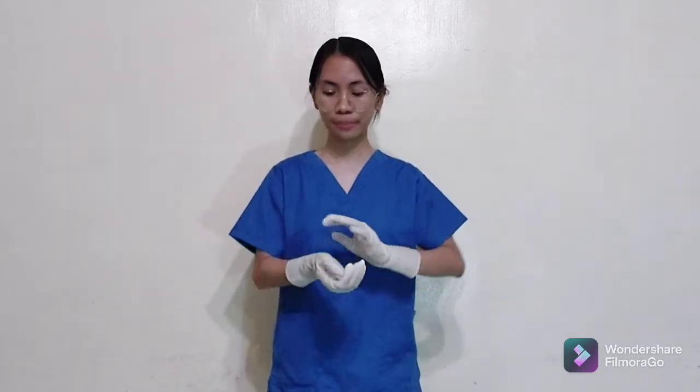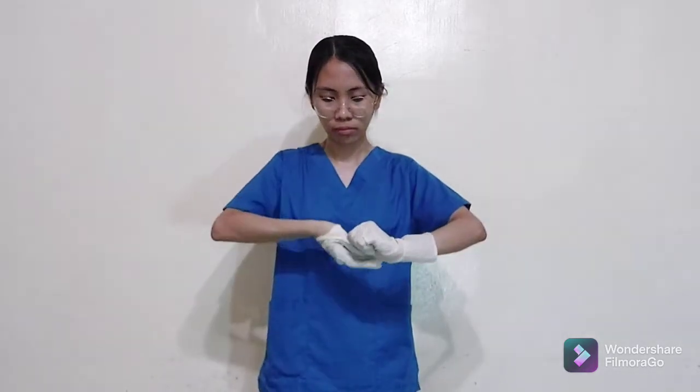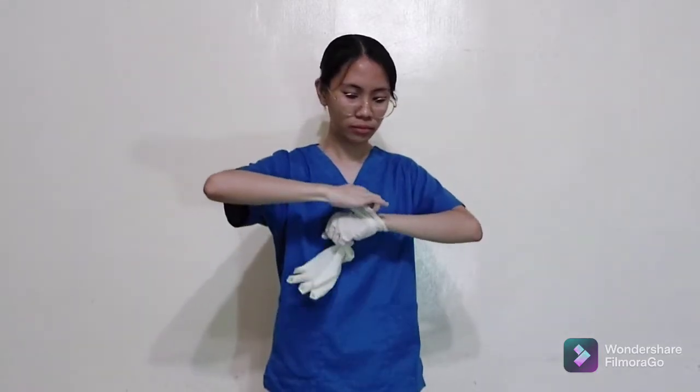I am going to ensure adequate lighting, as it helps with accuracy and speed of catheter insertion. Remove gloves and perform hand hygiene. This reduces the transmission of microorganisms. Discard it, then perform hand washing.